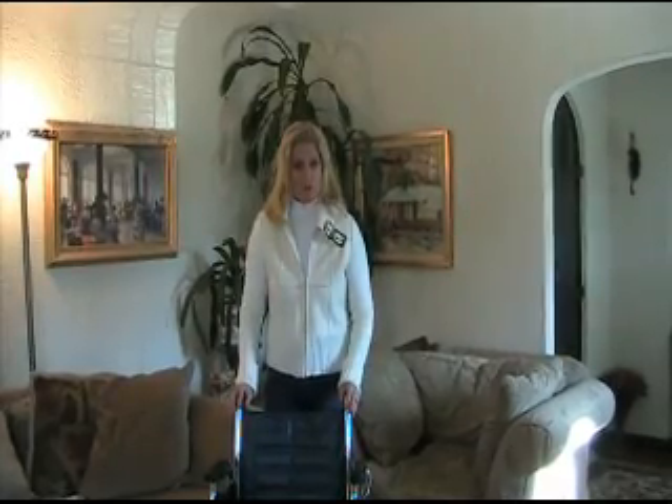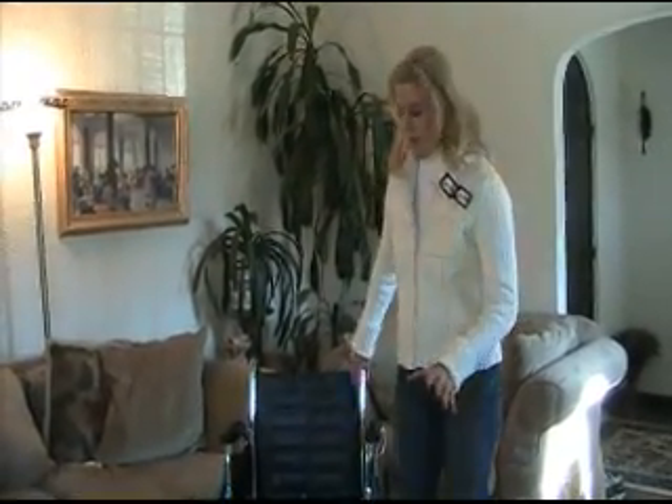Hi, my name is Kathy and I have a great safe wheelchair to show you. How many of your loved ones have gone in a wheelchair and when they try to stand up, it rolls backwards and they fall? Well, we've got the answer to that problem.